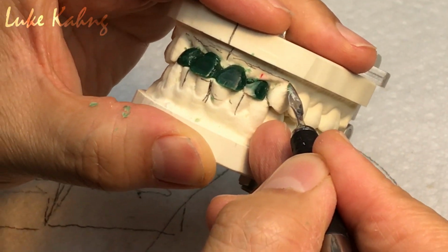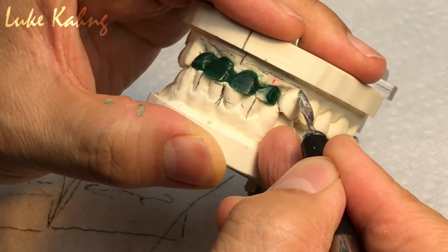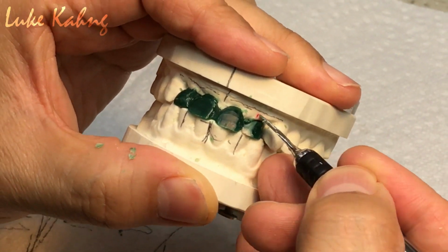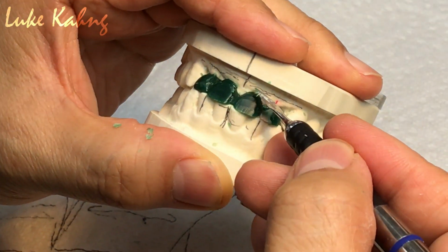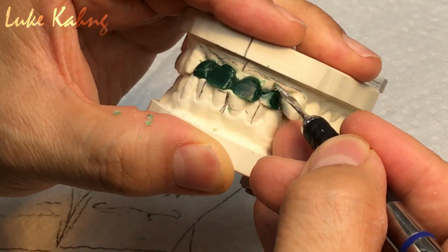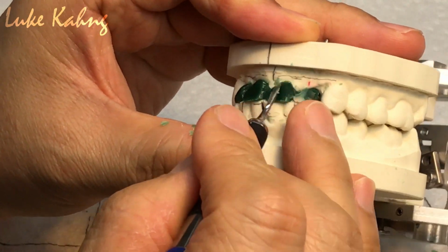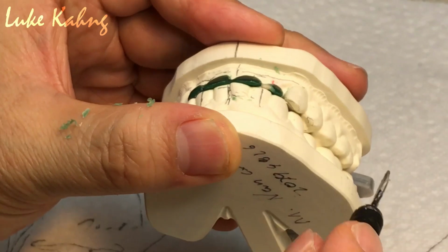Because this is too long, I don't have to follow that. Canine is longer, yeah. Tissue. So here is my final lateral. Okay, central a little bit longer than here's my final. So kind of a little same. Now once I'm done with the central, right now alignment you see. Okay.